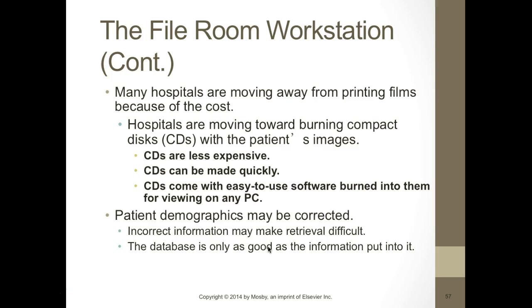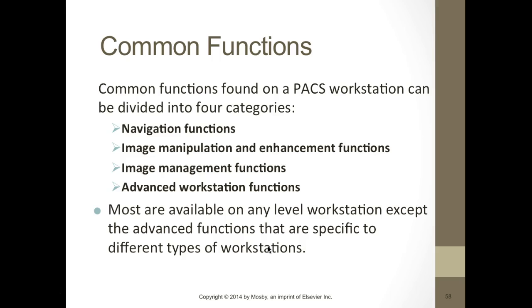Patients' demographics can be corrected also on the file room workstation. Don't usually like it to get that far. You want to fix it before it gets that far.